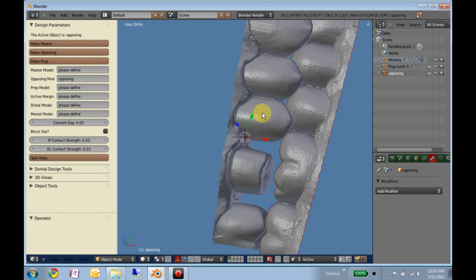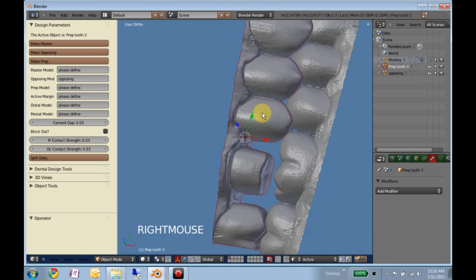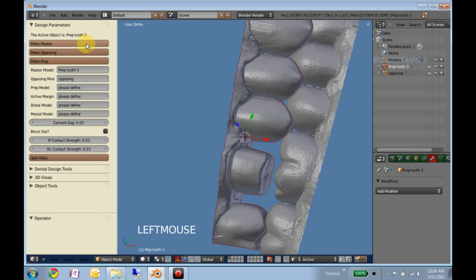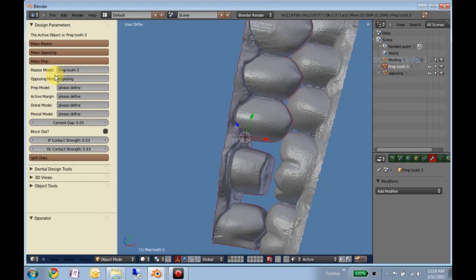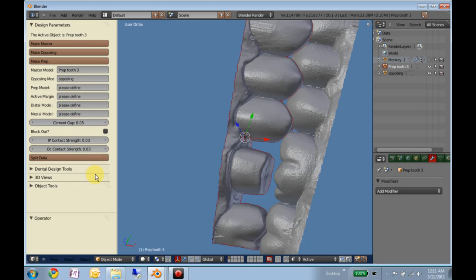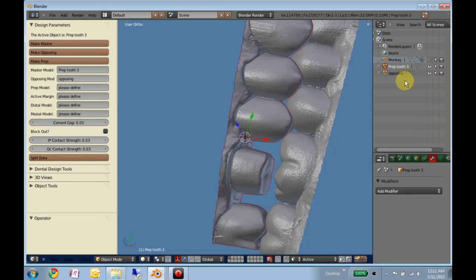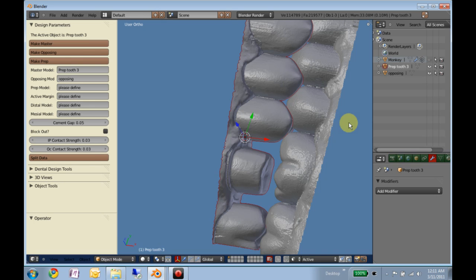We'll now right-click on the model with the prep on it, now it's highlighted in red, and we'll make that the master model, and you'll notice you get feedback here in these little tabs. The prep model, the margin, distal, and mesial will all be defined as we work through, but having these able to be defined as any model in the outliner will allow us to work on multiple restorations at the same time later.